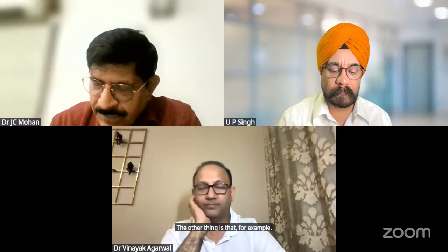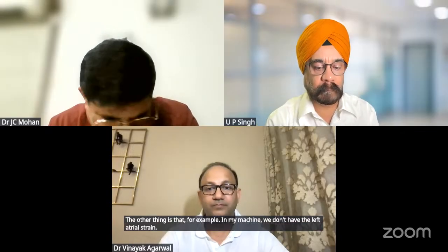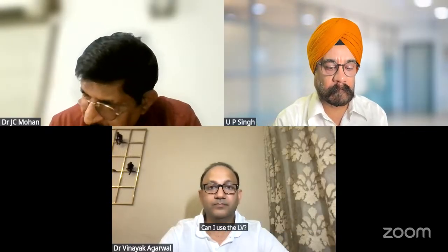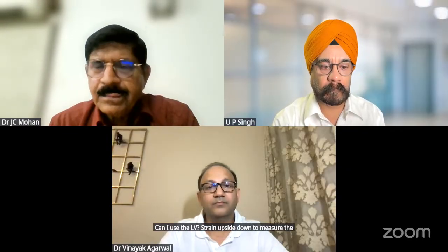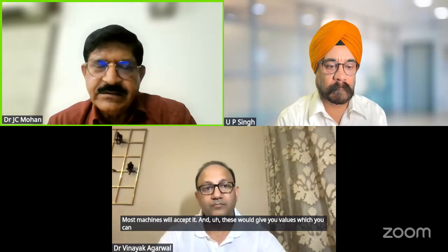The other thing is that, for example, in my machine, we don't have the left atrial strain. Can I use the LV strain upside down to measure the LA strain reservoir? Dr. Qureshi, I agree with your both comments. You can use the LV strain algorithm for left atrial strain. Most machines will accept it. And these would give you values which you can interpret correctly.